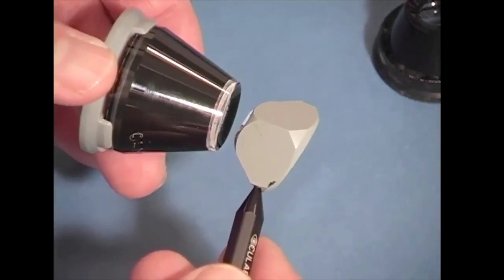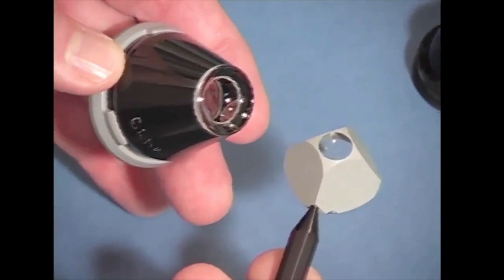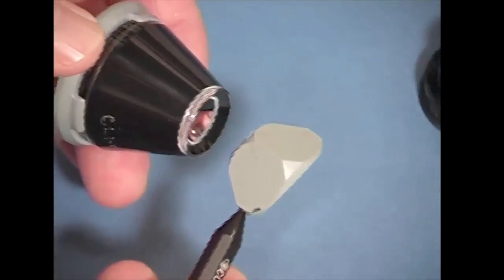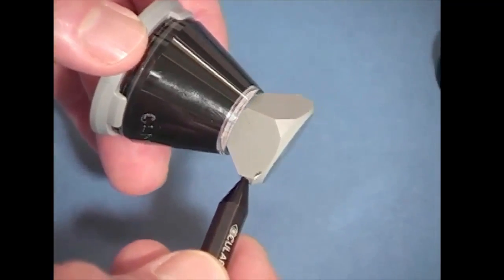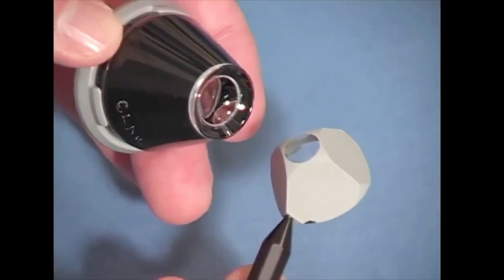You see that the area of contact is much, much smaller than with a 3-mirror Goldmann-style lens. And that's why this lens works so well for indentation and the bigger lenses don't. It also is one of the reasons that you don't really need to have a coupling solution. And now we have this lens on the eye. You can see there's always a little bit of air flashing under there because I don't want to be pushing. And I can see all four quadrants just that quickly, just by going from mirror to mirror.